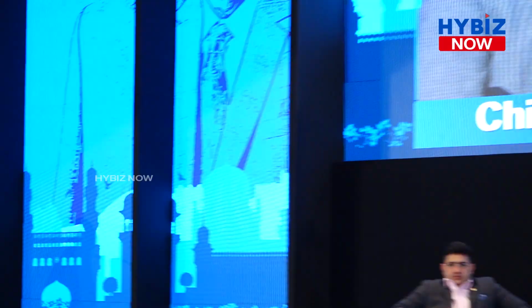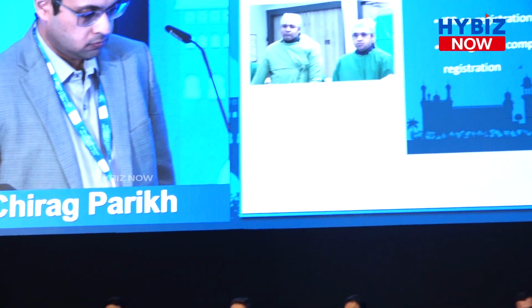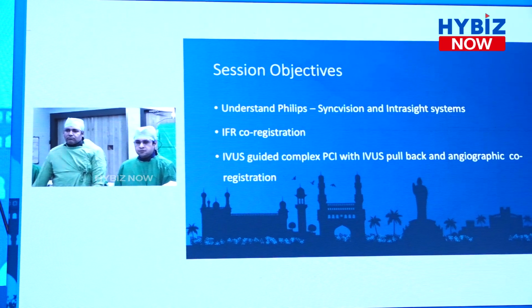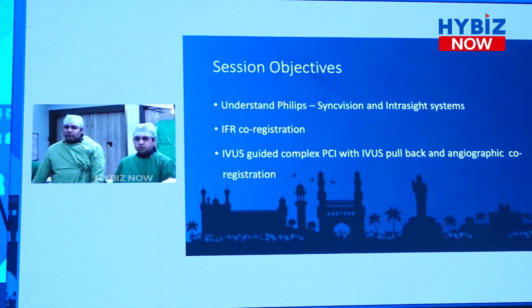So today we'll be presenting a live in-box case. These are our disclosures. Next slide. So today's session objective is predominantly to understand the Philips Sync Vision systems, which integrates all the physiology and imaging modalities, especially the IVUS and IFR modalities into one package, in addition to certain additional features which are available, which we will be demonstrating to you.